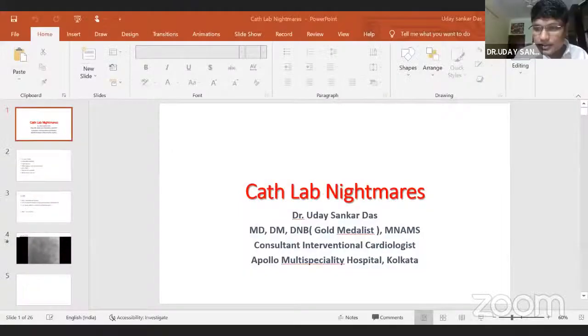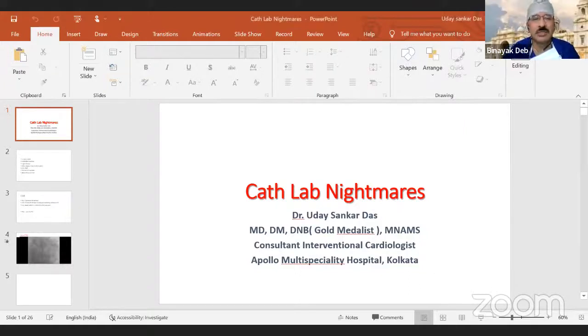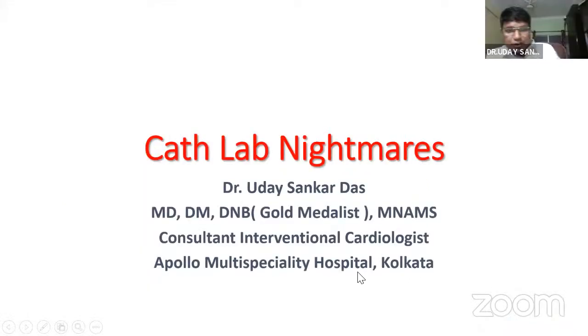Is it visible? My slides are visible? Yes, your slides are visible. If you maximize it, Dr. Uday. Just 2 days back, I was asked to show some complication in my cath lab. Fortunately or unfortunately, one complication happened just the day before yesterday, and that is why I'm showing this case. Thank you, Albert, for inviting me.